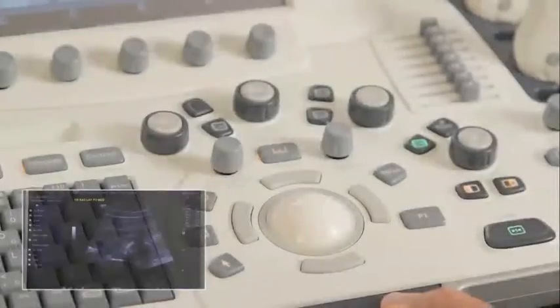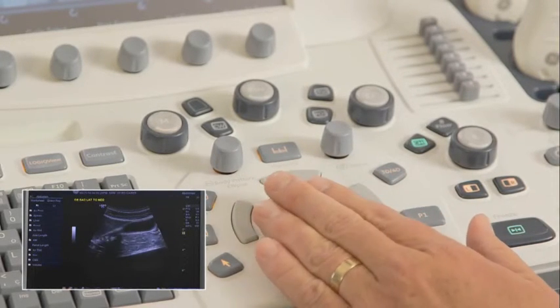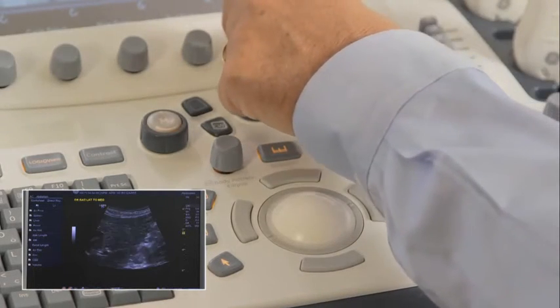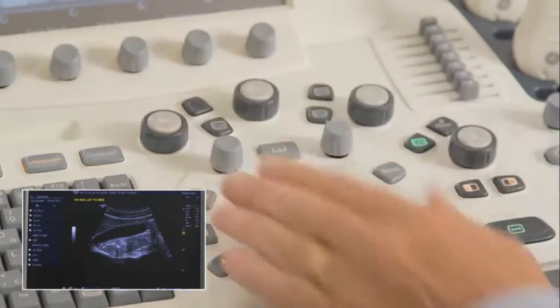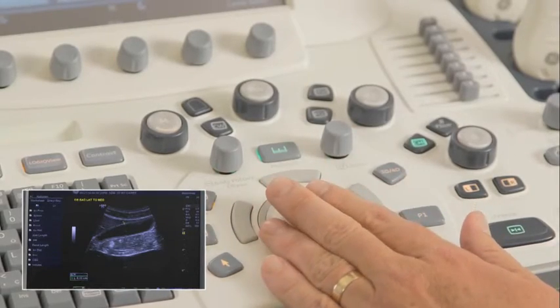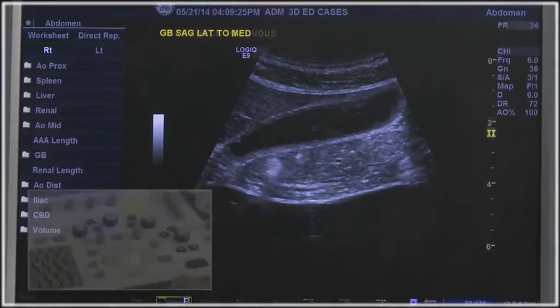Pull your 2D images from the cine clip by reviewing the clip. You can do this frame by frame using the toggles associated with your Cine tab, or simply roll the trackball until you have the desired 2D image. Capture the 2D still frame. Measure the 2D image as needed. Once you have retrieved your desired information from the Cine clip, you can end your study.